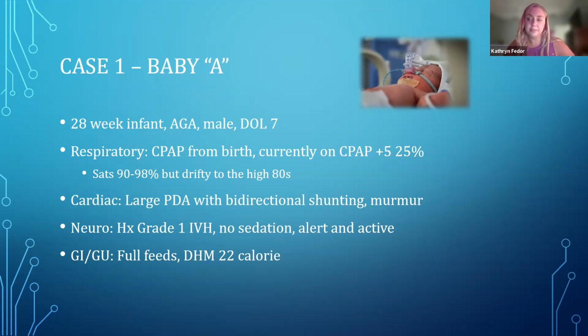He's a little drifty on his sats, but he's very stable. He does have this PDA. It'd be very interesting to see what his NIRS looks like. His skin was in great condition, so he was a good infant to trial this on. So we put the NIRS probes on him.